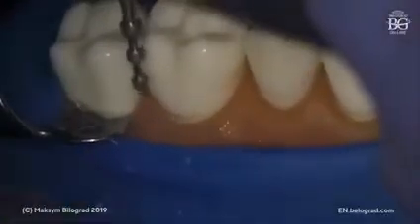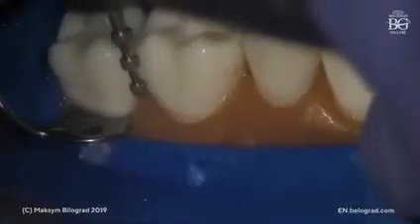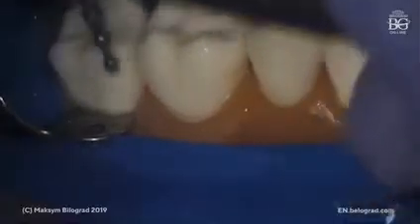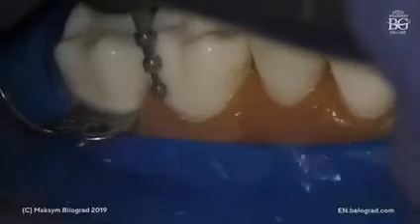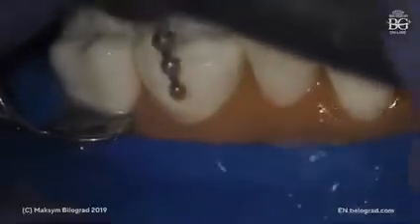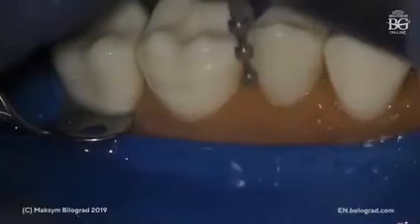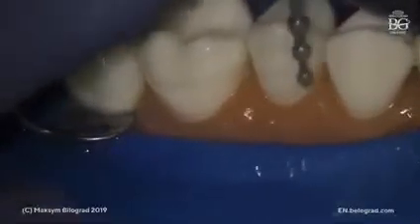So let's go. A lot of water. You go within the surface. You see, if you keep the correct angle, you will not be able to go deeper. So you go within this surface. The burr has to be driven parallel to the surface that you prep. This way you will get equal, or let's say adequate, preparation.